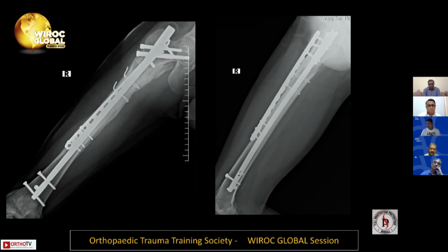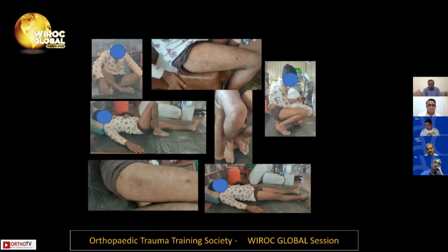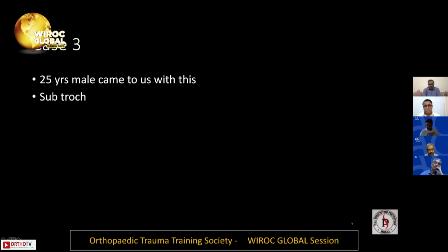And this is a concept which Kojima invented, that absolute stability may go into the issues of the subtrochanteric fractures. Because of the lockdown, he could not come, so he sent me the pictures. He's working on the farm, and he's fine with the movements, and everything is fine.